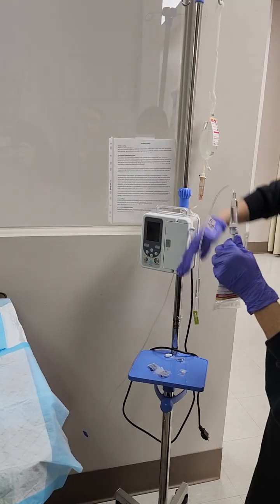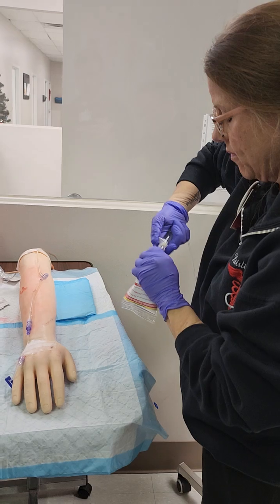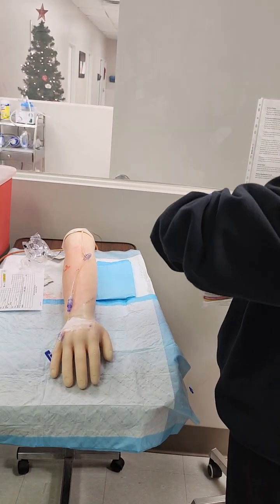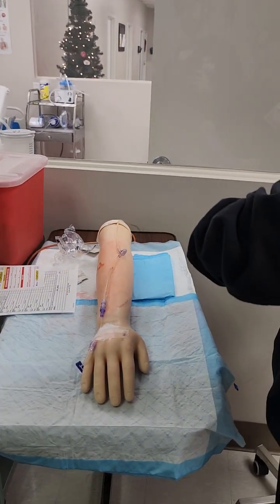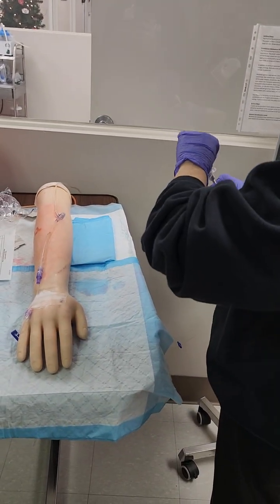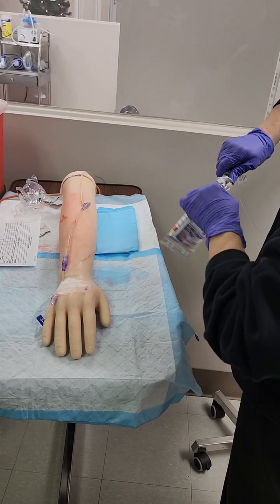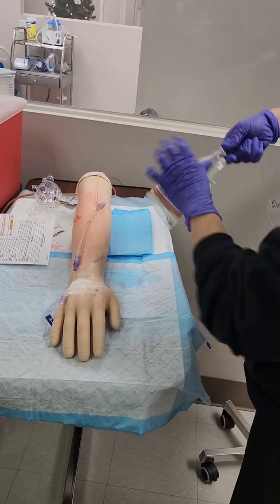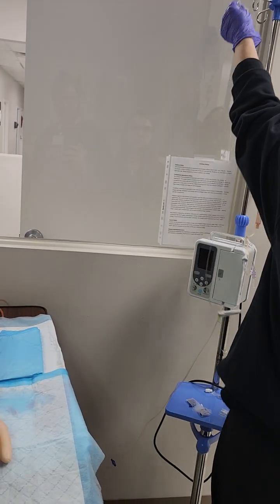It's still not going. You may just squirt some of it out. Push and twist. We just want to make sure that it's only about half full, that way I can see it dripping. So I'm going to hang this up here.